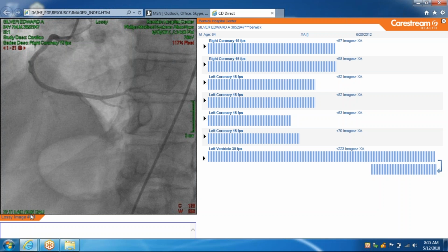And then if you look right here, it says caudal 6.0, roughly 6 degrees. Caudal means the camera is tilted toward the legs. If cranial, it's tilted toward the head; caudal means it's tilted toward the legs. So you have to understand this jargon.